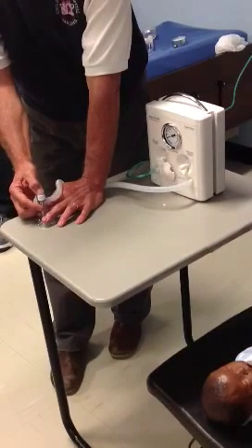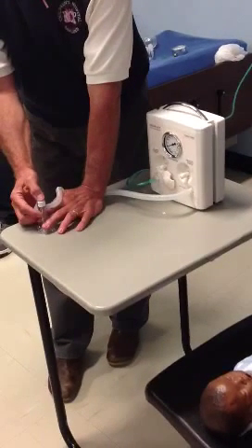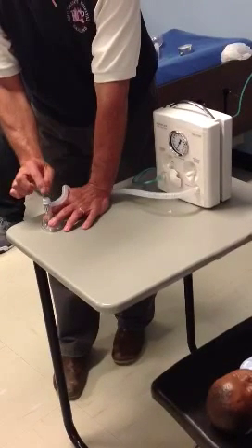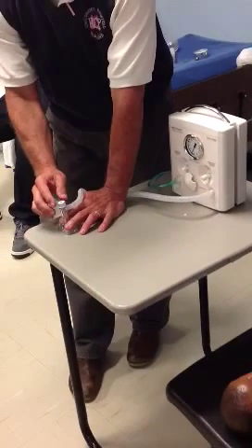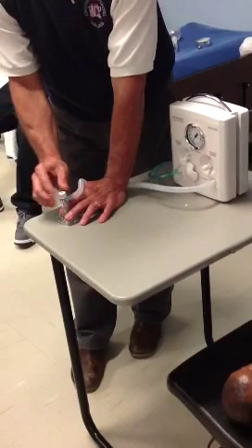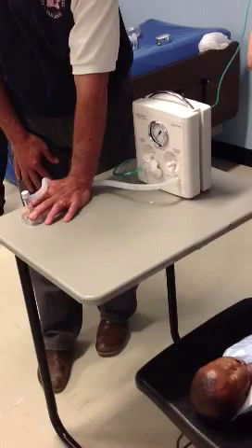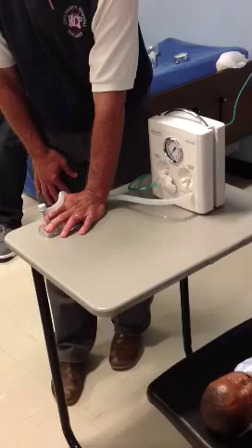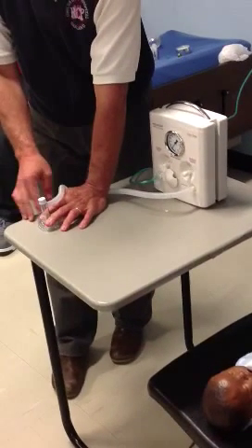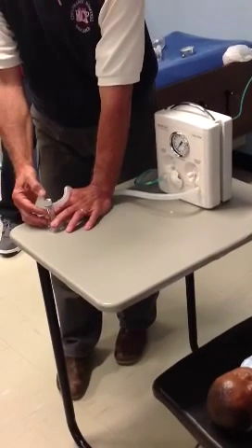The advantage is I give a consistent amount of pressure each time. All I do to give a breath is occlude the orifice, which is connected to the PEEP valve. If I want more PEEP — if I'm just giving CPAP — I increase it. Now I'm giving 10. The baby can breathe spontaneously through it; they have an exhalation valve right here. So now I'm 20 over 10.